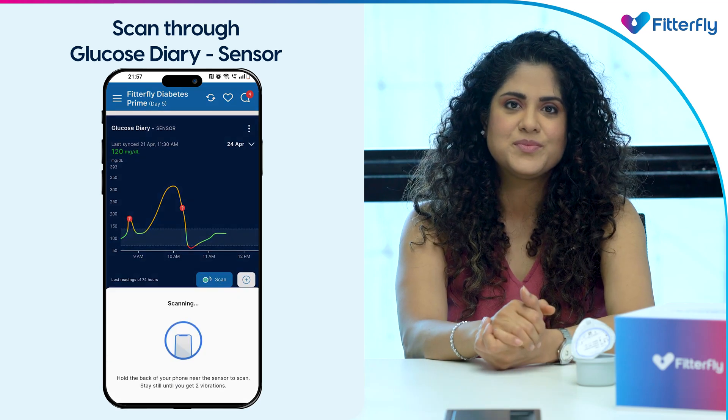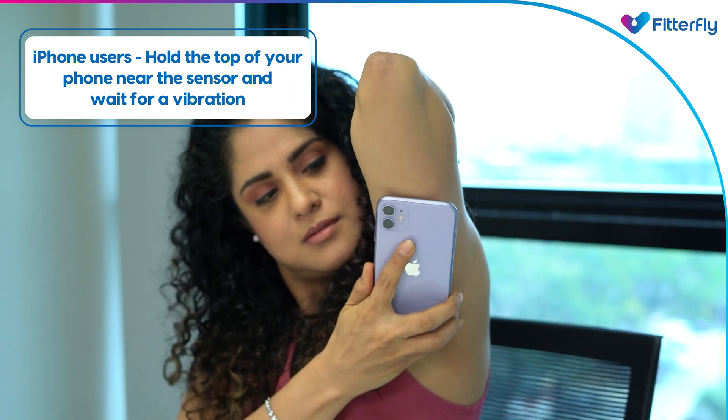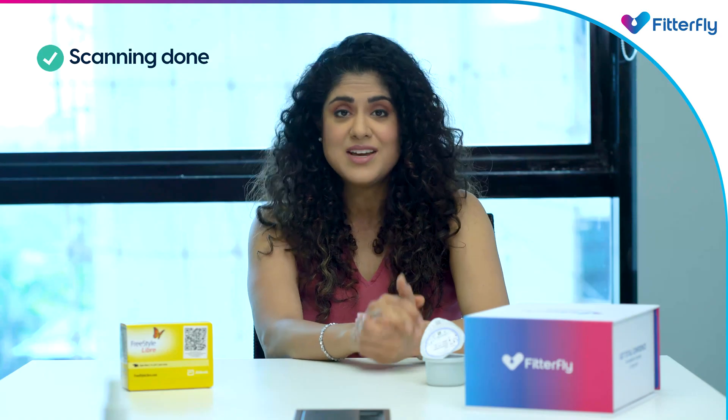If you have an iPhone, hold the top of your phone near the sensor to scan and wait till you get a vibration. If you have an Android phone, hold the back of your phone near the sensor to scan and wait until you get two vibrations. You can scan your sensor every eight hours.